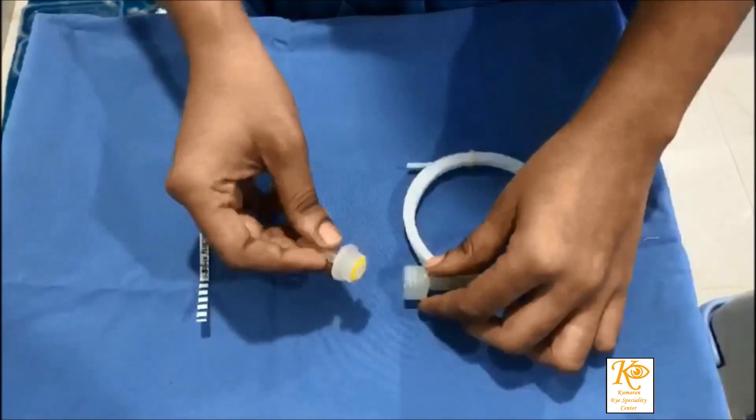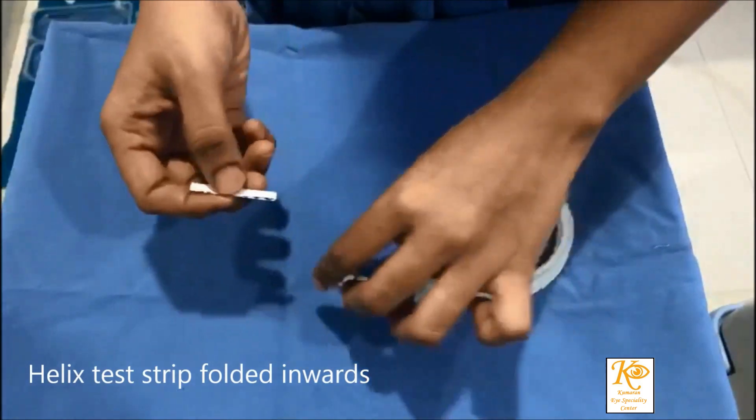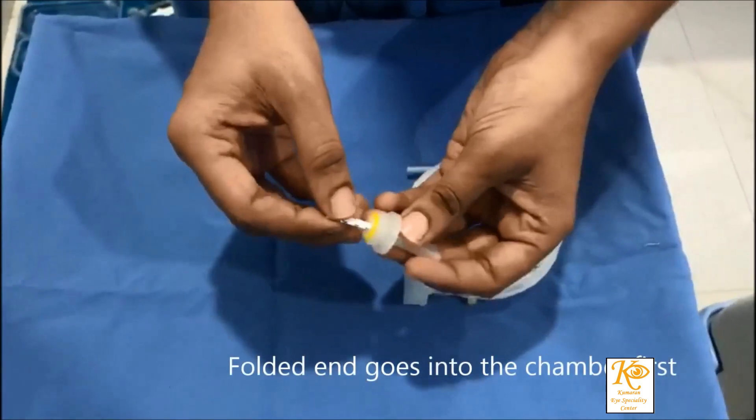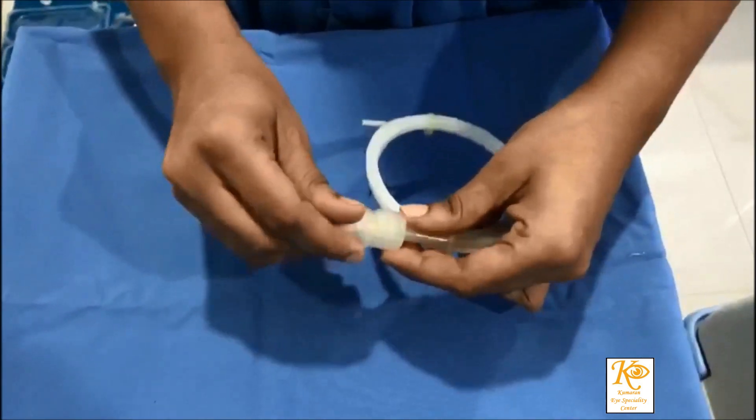The Helix test consists of a 1.5 meter long spiral tube with an internal lumen of 2 millimeters. One end of the tube has a plastic casing into which the test strips are placed.